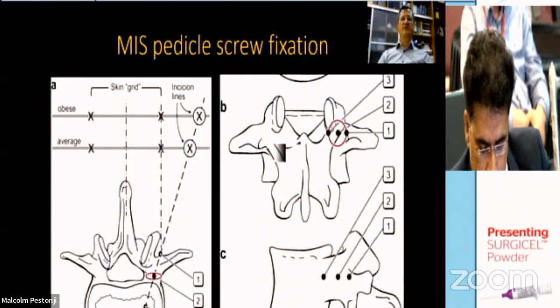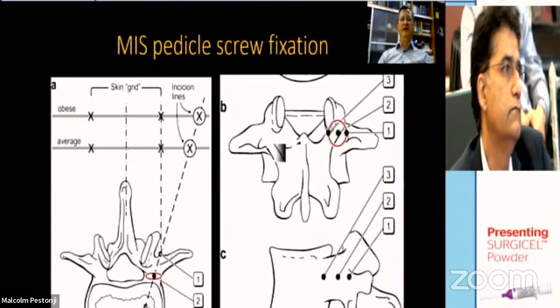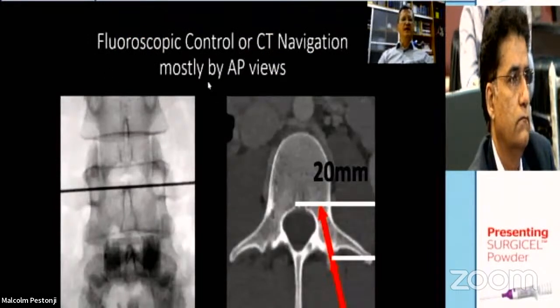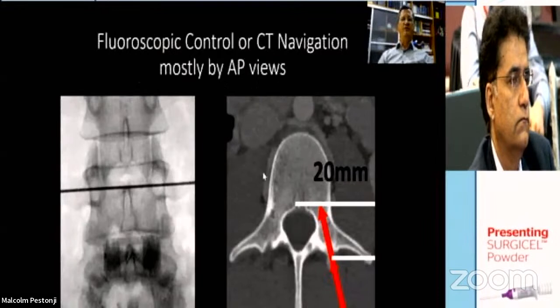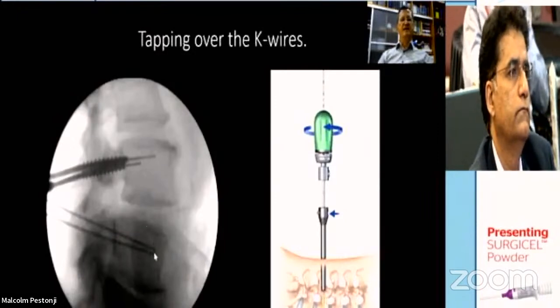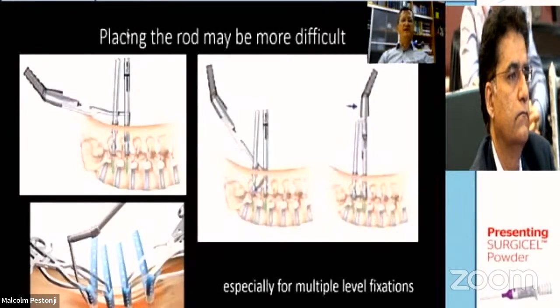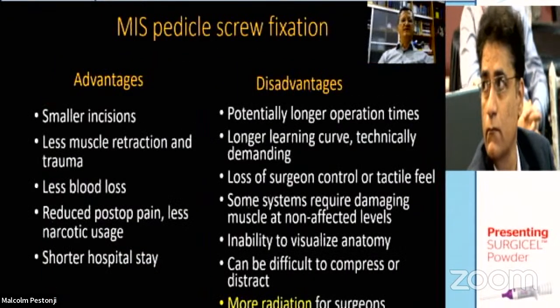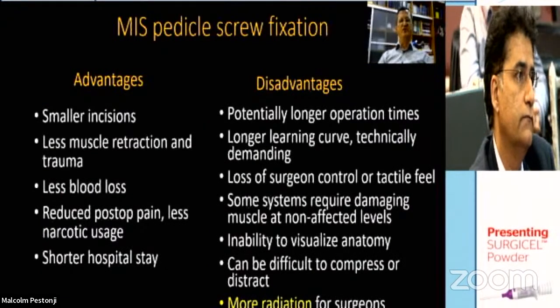You must learn radiologic anatomy very well, especially AP fluoroscopy; radiology is very important. And CT navigation can be used, or if it is fluoro only, AP views can be used. Most surgeons prefer a cannulated screw. So first place a K-wire, then place a cannulated screw over the K-wire. But placing the rod may be more difficult. Kevin Foley has also developed a technique for that, the so-called Sextant system. It was adapted for short segments, but it can also be used in longer segments with some modifications.